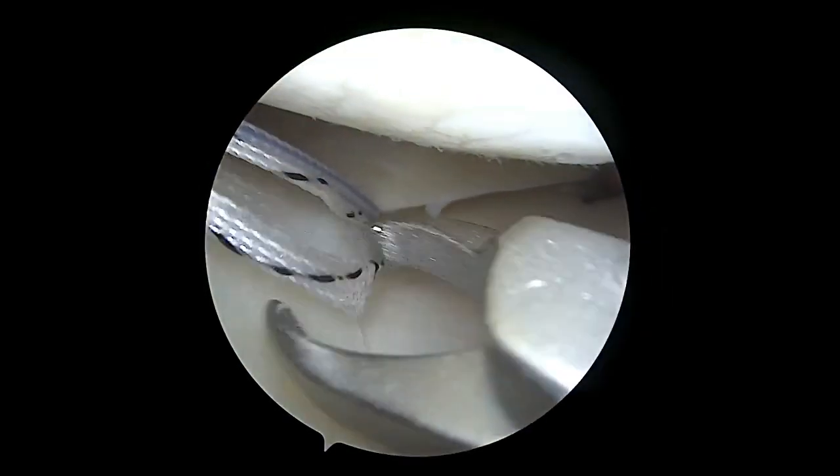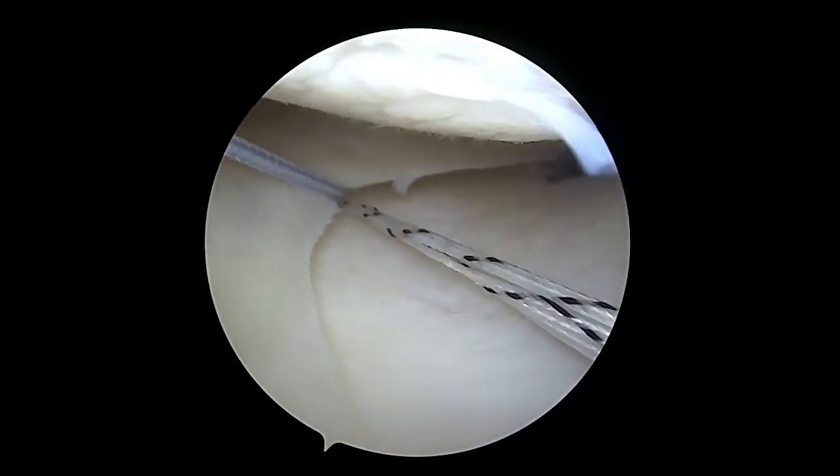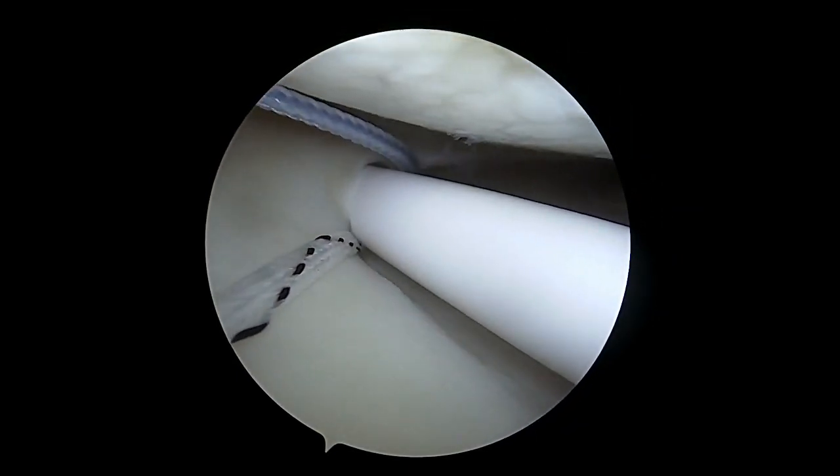The shuttling link sutures are then parked out of the anterolateral portal. We then introduce an Arthrex fiber stitch all-inside meniscus repair device into the anterolateral portal for a better angle and access to the centralization fixation point.